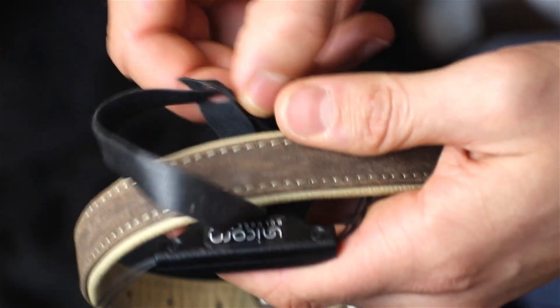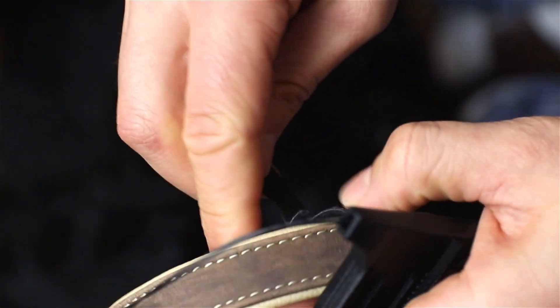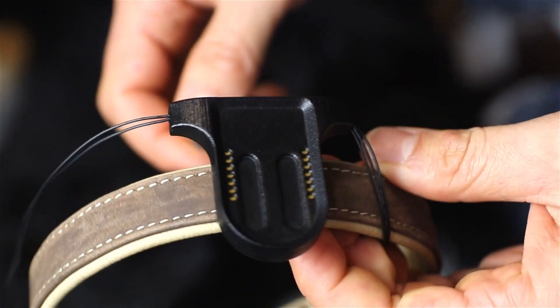Secure the base station to the collar using the Velcro straps. Choose a stable and practical position that best suits your use case, ensuring that the base station is firmly attached. Once secured, place the collar on the dog.